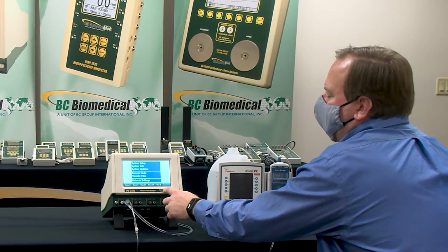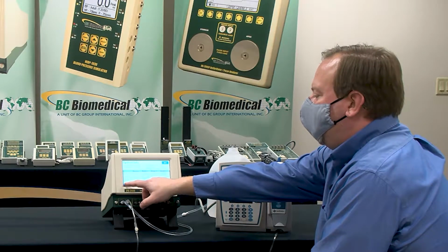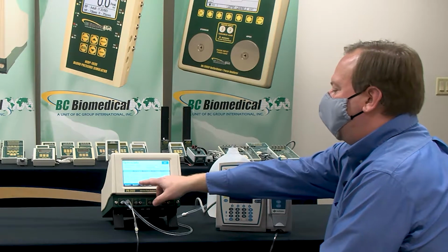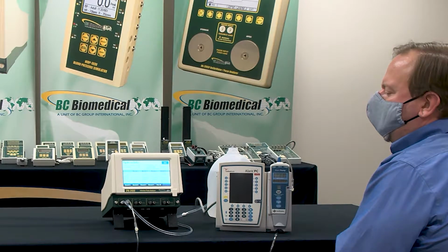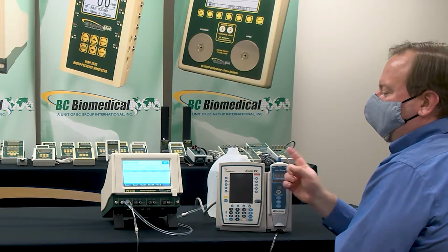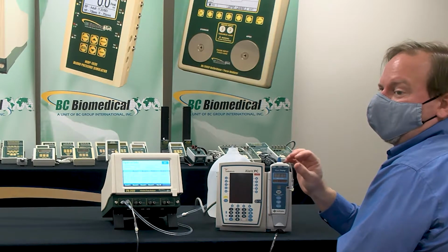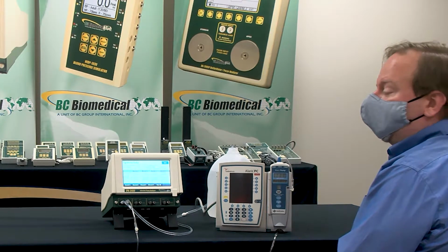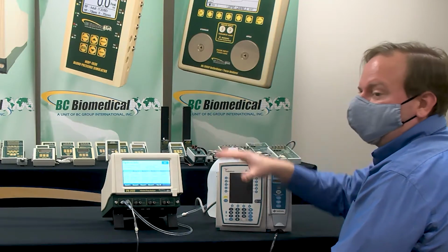If we want to talk about the system info, the clean time. This is the time since the last cleaning. I've got to remember exactly what that number is. I think that's accumulated cycles, or maybe it's tests. I don't think it's minutes or anything like that. But basically when that gets to a certain number, that's when you should run the clean.